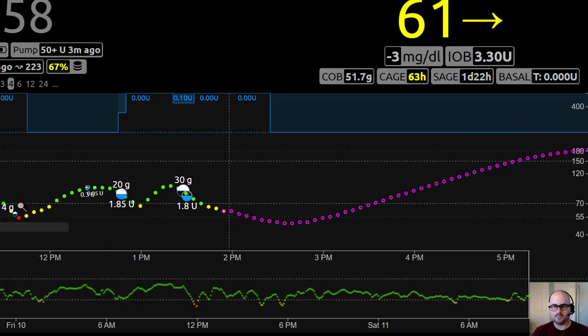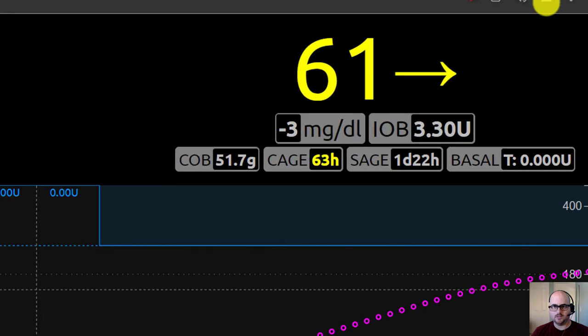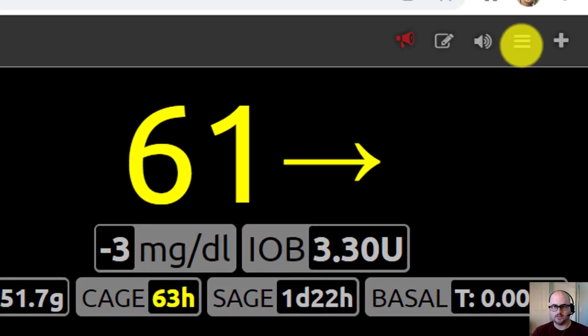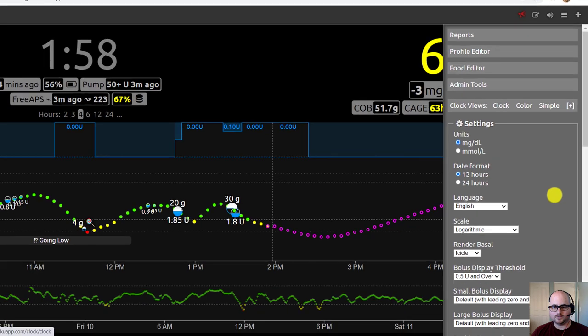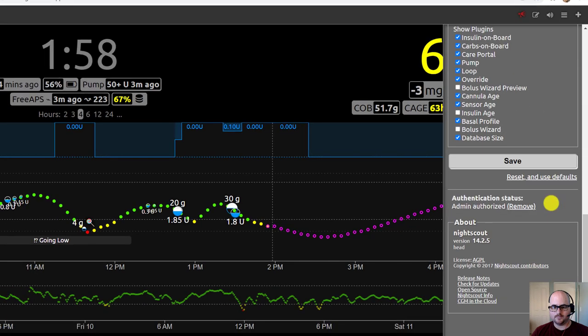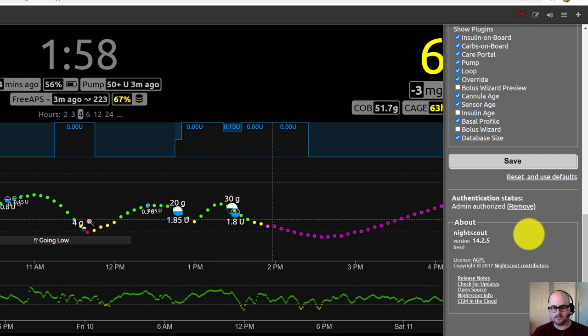Top right, you'll see the menu or the hamburger icon here, the three lines, and you scroll down to the bottom, and you'll see Night Scout currently at 14.2.5.